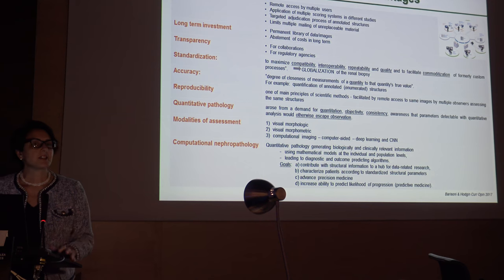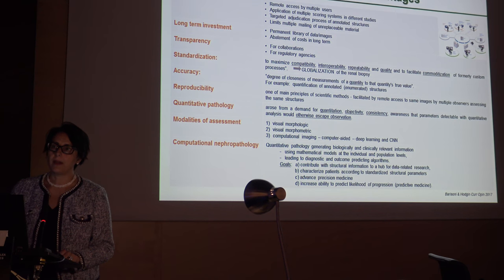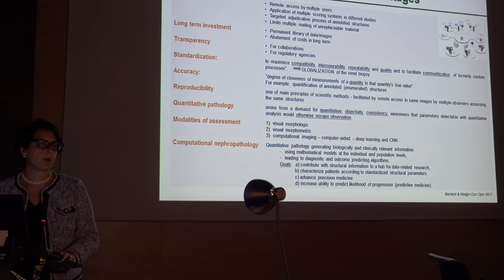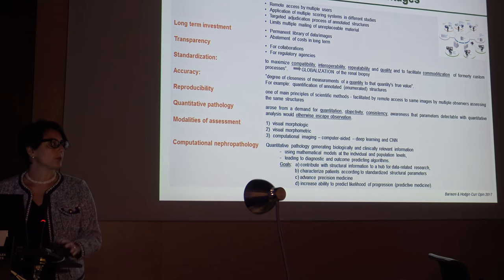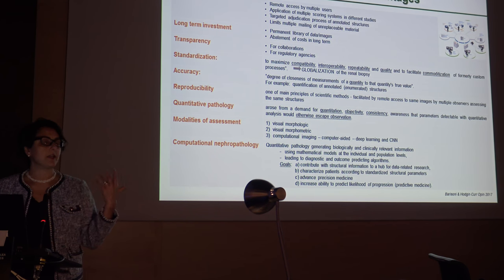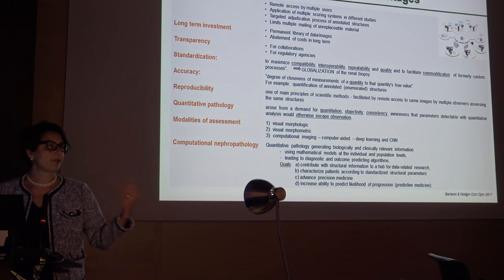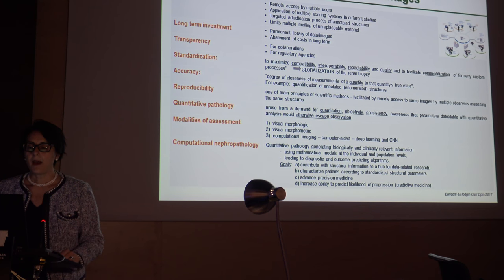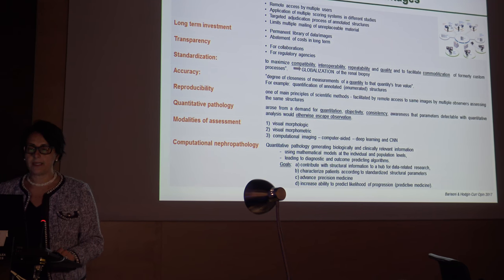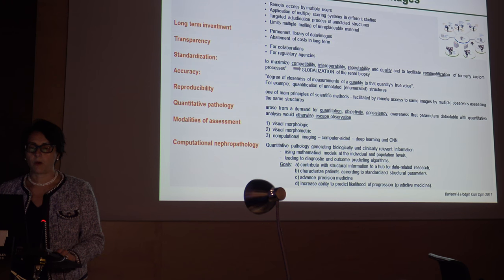Why is digital pathology becoming so popular, and why is it being implemented in many of the things we do today? There are several advantages. First of all, it facilitates the workflow. It allows remote access by multiple users to the same image, which can be used over and over again. In clinical studies or for other purposes, we don't need to mail the precious glass slides from one site to another. In this way, we can create a permanent library of data and images. Although there is an initial investment, with time there is an abatement of the cost.